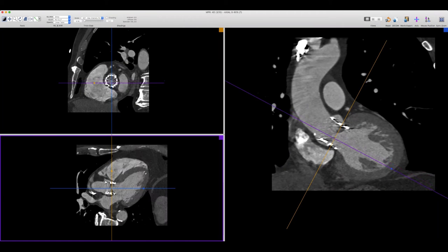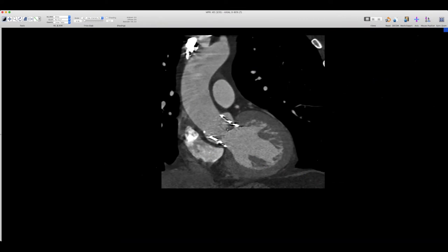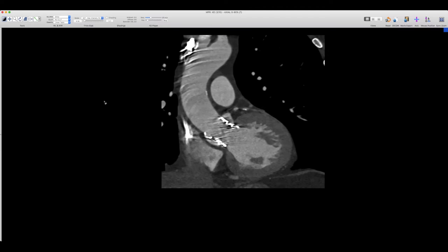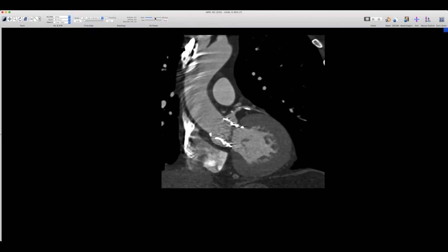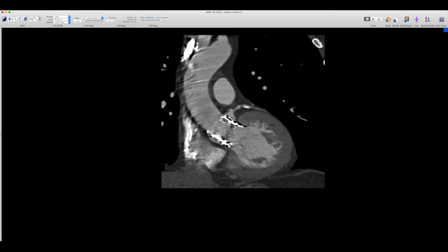Good. Okay, so I'm going to show you the cine sequences here, but already you can see that there is abnormal thickening of the bioprosthetic TAVI leaflets. Let me just play this. It does this every time where it takes off my play bar. I'm going to put it back on. Space bar, see if it goes. Oh, there we go. Now you can see that the TAVI leaflets are abnormally thickened. Let me speed this up so you can see the motion. Abnormally thickened, and they're also restricted in motion. This one in particular, at the base, is just barely moving.